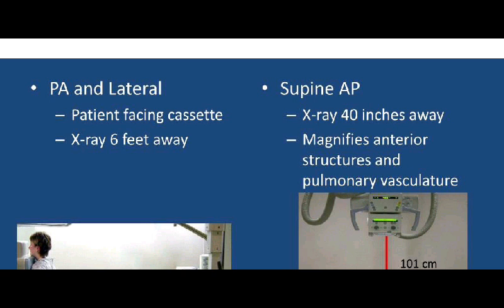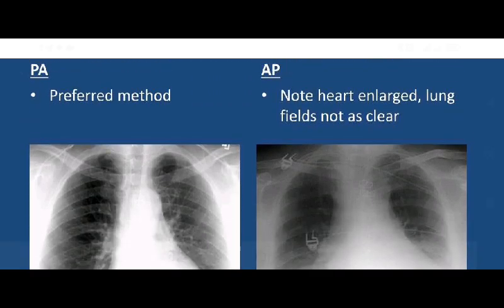When you do an AP, when a structure is far away from the cassette, the organ itself tends to be magnified. So we are expecting that. When you are checking, you should be careful that you do not see the heart magnified based on your OFD or FFD and diagnose cardiomegaly. Most times when it comes to technique, if you are doing an AP projection, just have it in mind that you are not going to use the normal FFD you are using. You have to increase it. That is the law of geometry. Once the OFD is large, you have to increase the FFD to compensate so that there won't be much magnification. So we go over to comparing chest protocols.